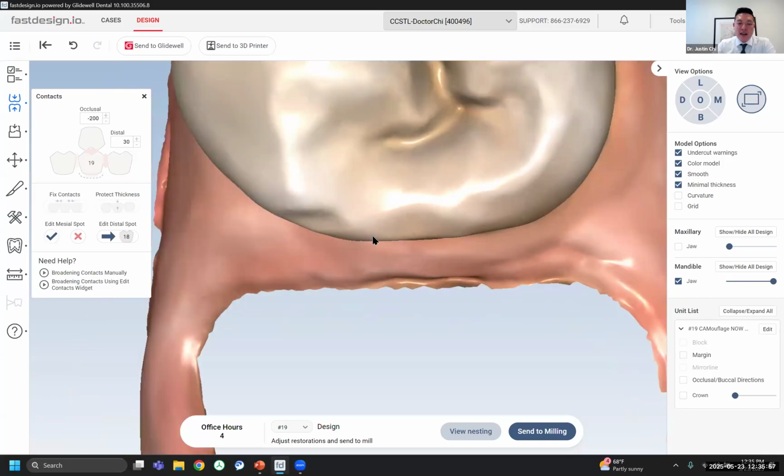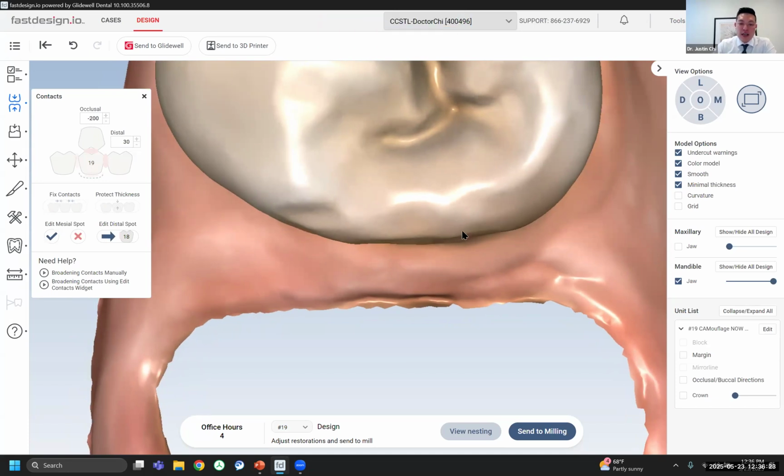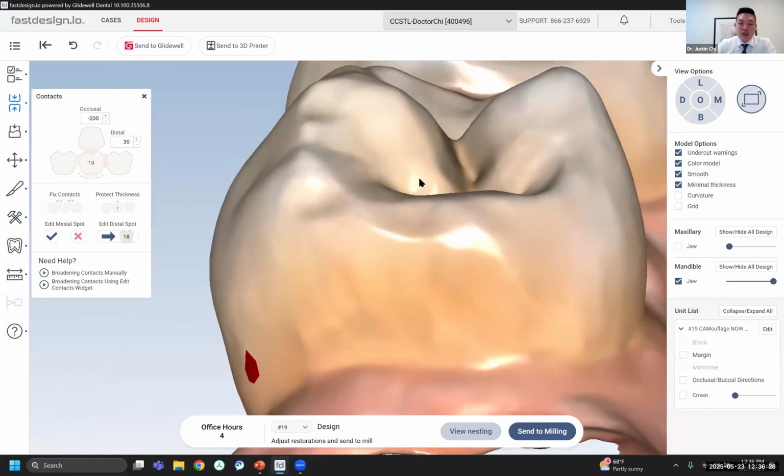convex. Beyond that, if we extend it more buccal or more lingual, our design begins to wrap around that neighboring tooth, and that creates a challenging hygienic situation. It's really hard to pass floss through it. It's really hard to brush away in those embrasures. We want for the design to kind of begin flowing away from the neighbor where that adjacent tooth is flowing away. So now that we can understand that area there, we can also utilize the reflection in the software.